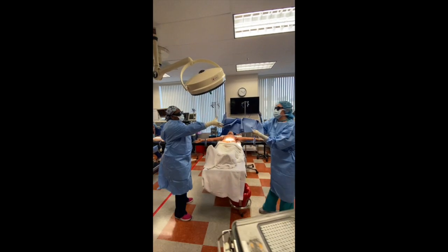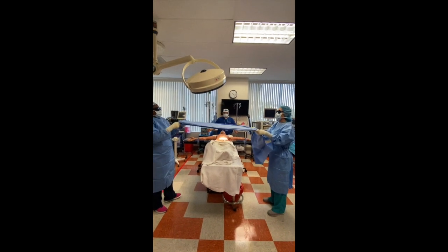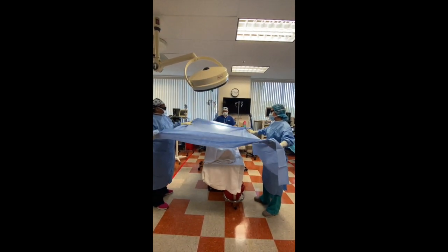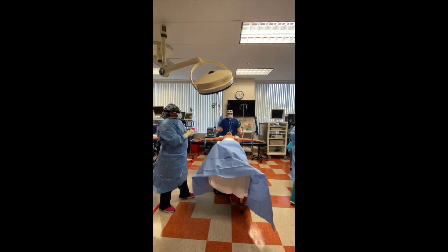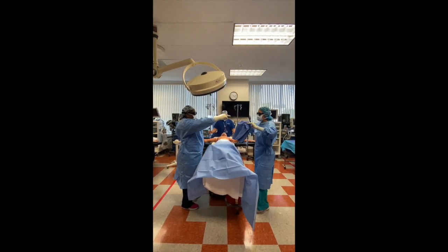Take that, please. Thanks. Three-quarter sheet first. Slow it down. Cuff hands. Drop it. Follow your surgeon. Hands stay up. Core towel next. Towards the surgeon first.